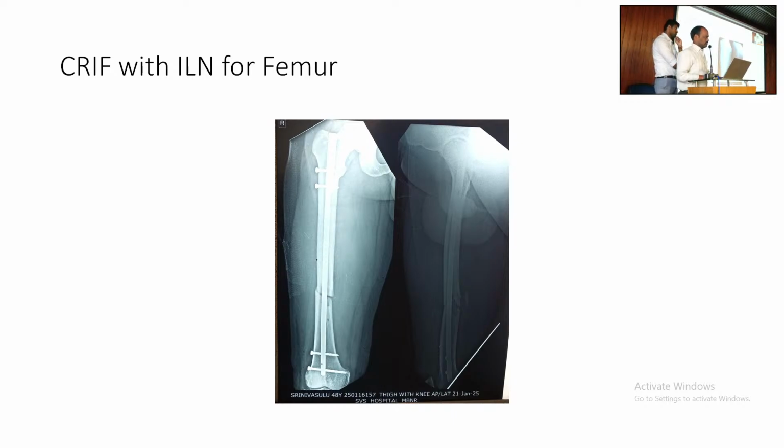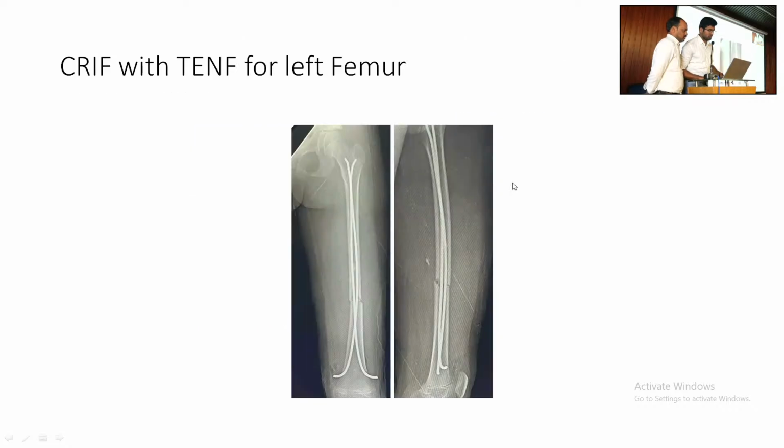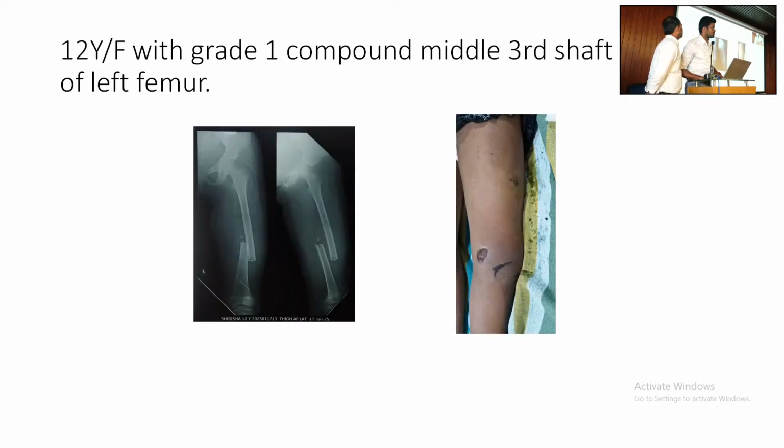Suprapatellar nailing. Twelve-year-old female with grade 1 compound middle third shaft fracture of left femur, sir. It was a puncture wound, anterior. Just a puncture wound, sir. Is it communicating with the fracture or not? Yes, sir, that puncture wound. Yes, sir.